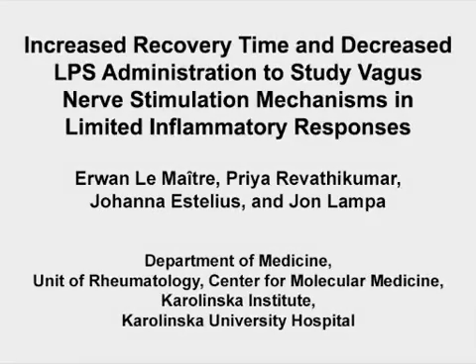The overall goal of this surgical intervention is to observe the effect of vagus nerve stimulation in inflammatory conditions, to analyze and understand the different mechanisms and cells involved in the so-called cholinergic anti-inflammatory pathway. This method was developed in the Kevin Tracy lab in the Feinstein Institute.